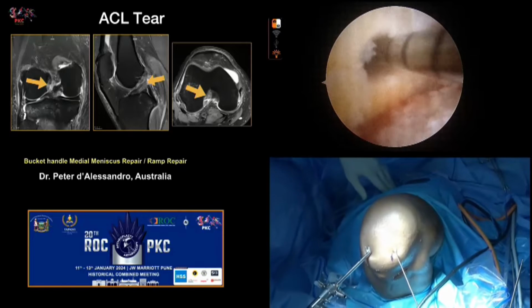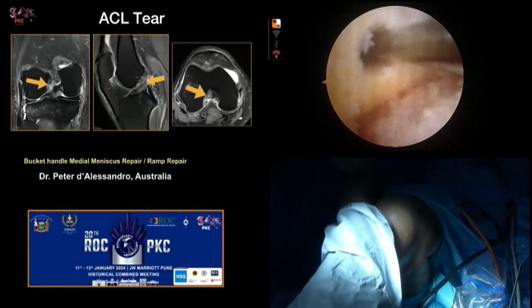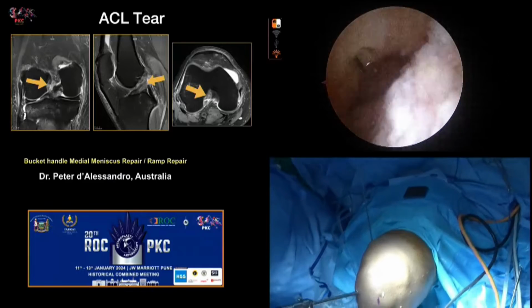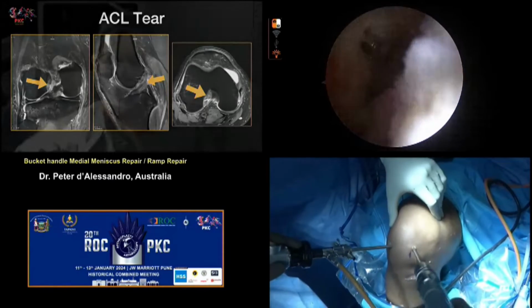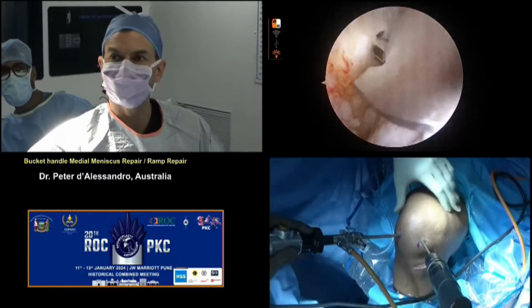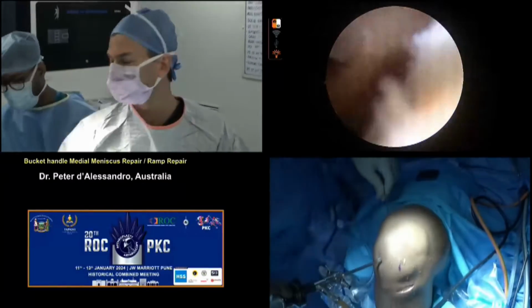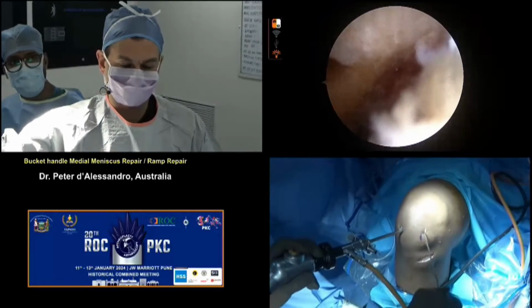So we can see here, I'm actually feeding the guide wire on hand. Something I learnt during my time on fellowship in Vancouver was this docking technique. To avoid hitting the medial femoral condyle, we'll actually dock inside the knee. So flex up now, guys. What I didn't do, excuse me, was use my depth gauge. Let's do that first. I'll measure, just take that one out. Yeah, great. Just do that.